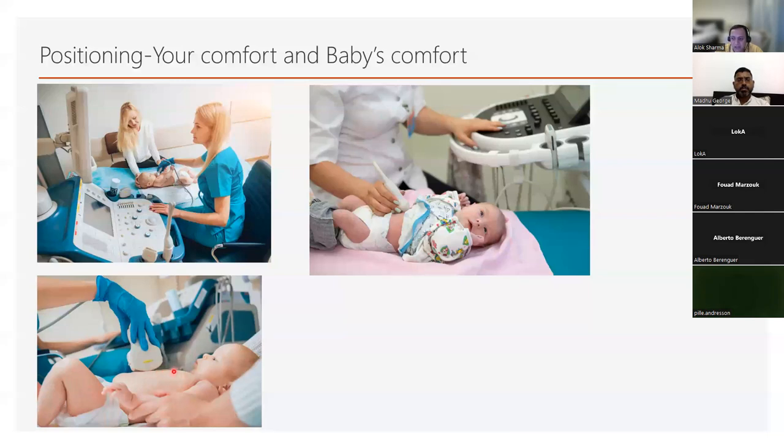You can get your anterior regions. And really when you want to do your lateral scannings, you just have to get that assistant of yours to lift the arms so that you can get into the lateral regions. And you can scan the back of the lungs through the posterior axillary line. So this is just a really good example of good exposure.